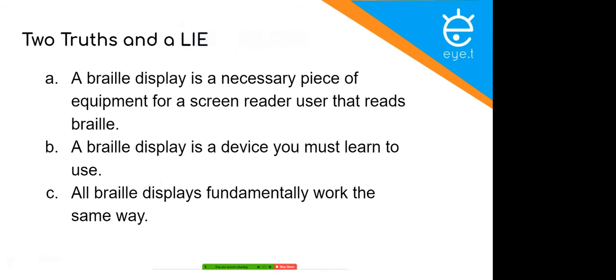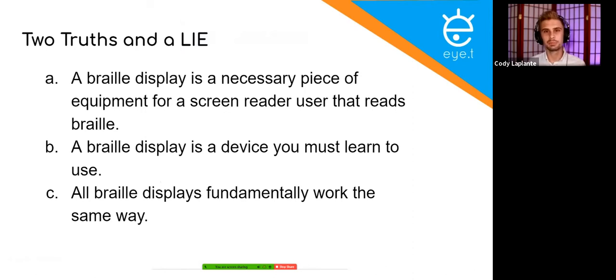What do you need to learn how to use? A screen reader and a computer is what you need to learn to use, right? A lot of people say to me, they might say, hey, Mr. Cody, if they're my student, or they might say, Cody, how do I use the Focus 40? Or I'm struggling to use the Brilliant 14.